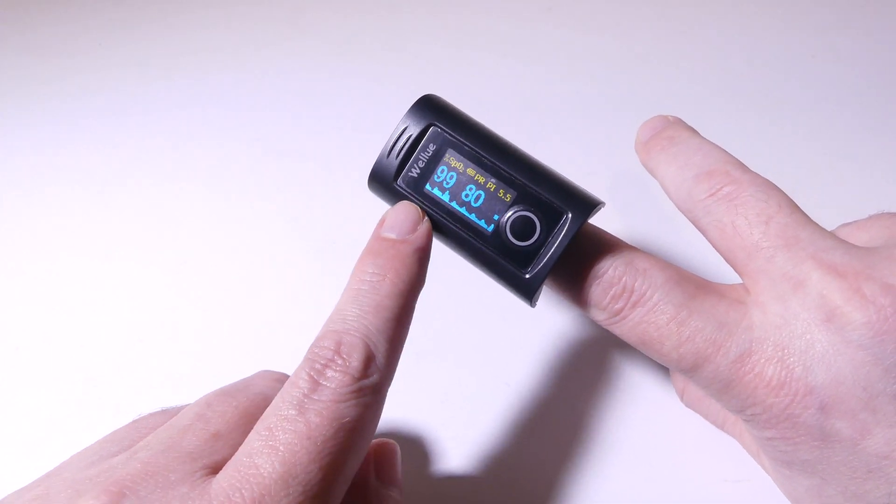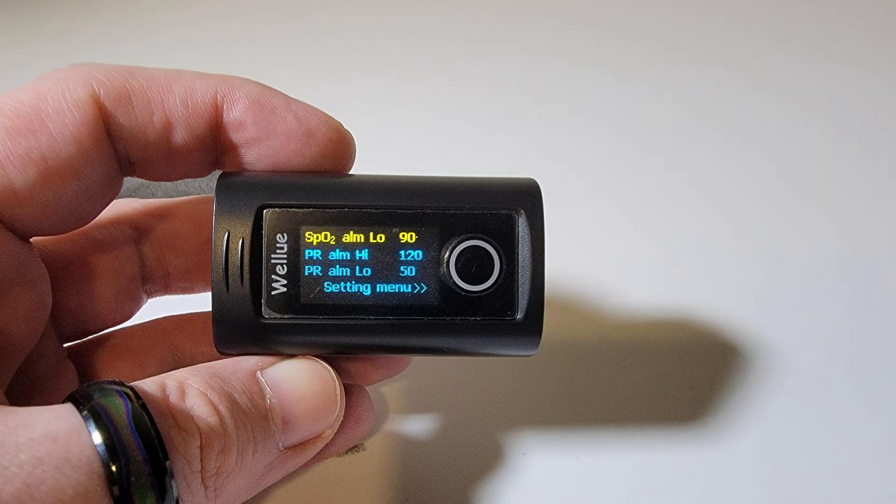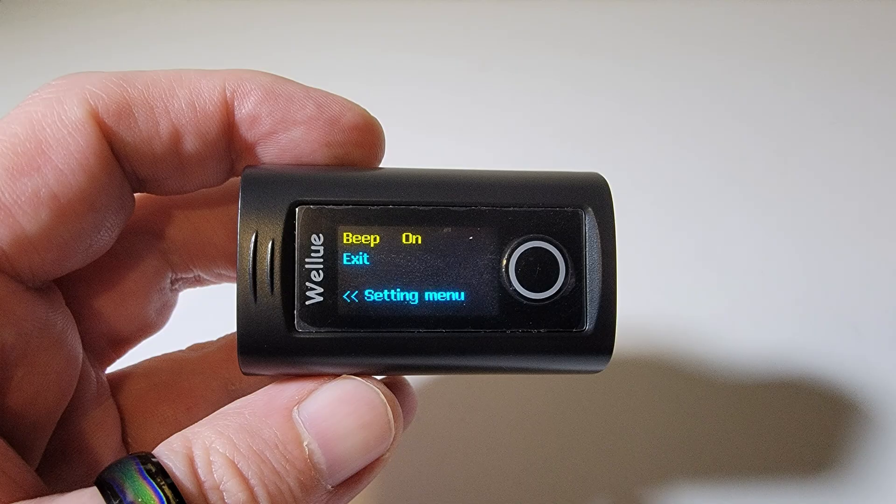You do have a menu button here as well. On the first page of the menu, we have an SpO2 alarm — it is a low alarm. The default is 90% SpO2 and you can change that. So if it goes under 90, you will get a beep and vibration to let you know you are under 90% oxygen saturation. They also have a pulse rate alarm: high default is 120, and if it goes over 120 you'll get that beep and alarm; low is 50. You can change those values as well. On the second page, you can turn the beep on or off, and of course you can exit out of the system.